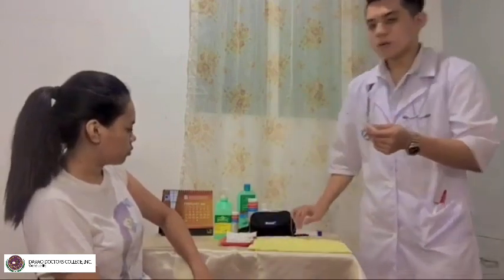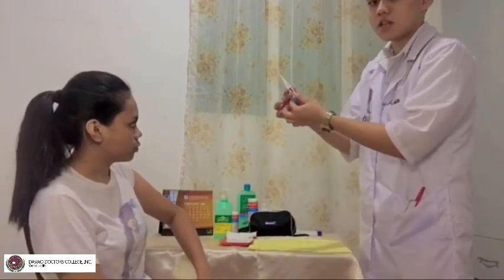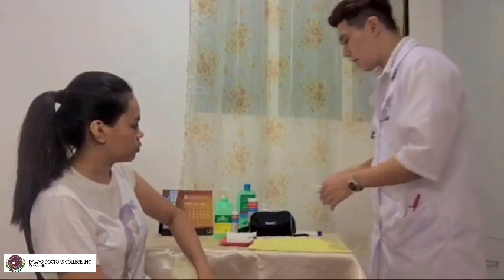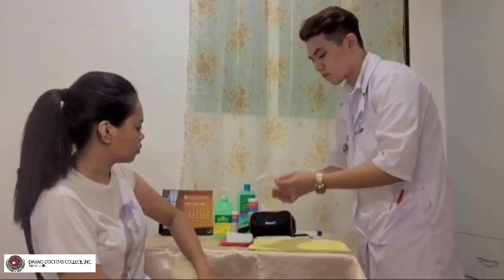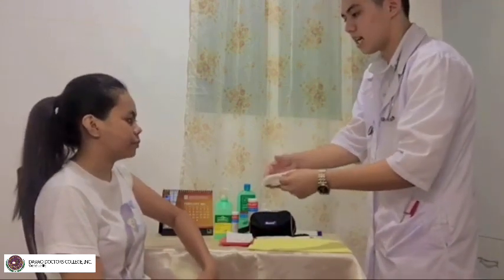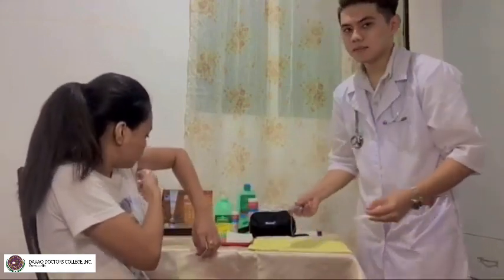Okay, so now I need to turn the thermometer on. So this procedure is very important because moisture can alter or affect the axillary temperature. So, ma'am, okay lang ma'am kung punasan ako or ikaw na magpunas. Ako na po punas. O sige, itap-tap lang ma'am ha. Okay, thank you.